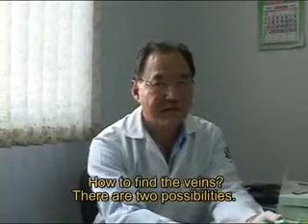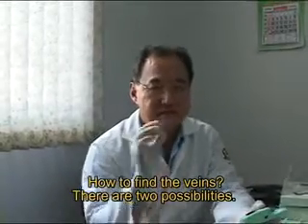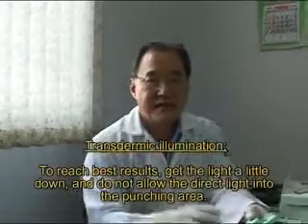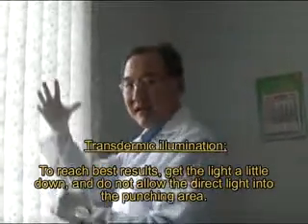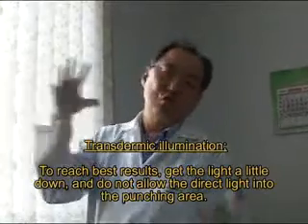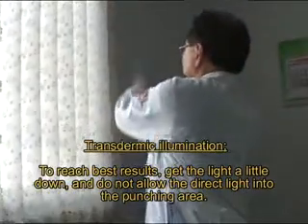How to find the veins? There are two possibilities. The first is transdermic illumination. To reach the best results, get the light a little down and do not direct the light into the puncture area.